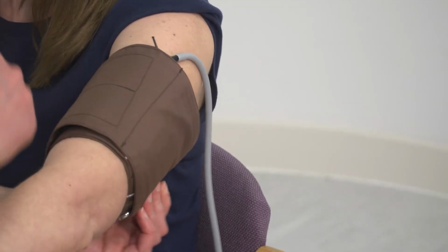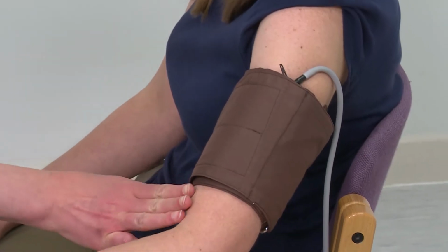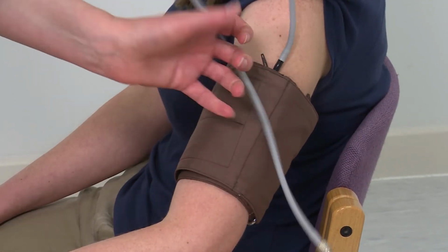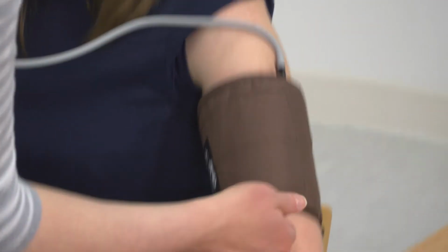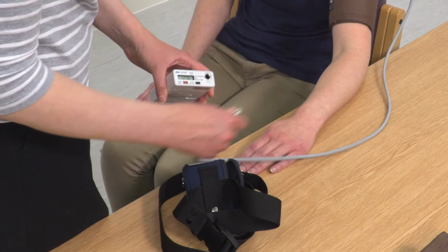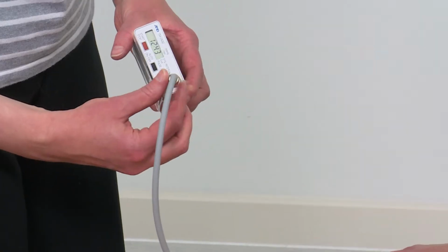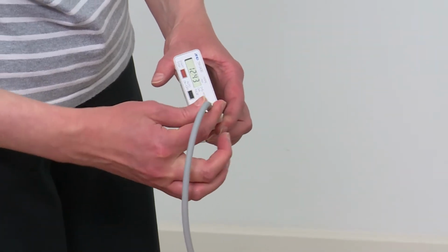The bottom of the cuff should sit at least 3 centimeters above the crease of the elbow. Tighten the cuff so you can fit your first and second finger between the cuff and the patient's arm. If the cuff is not positioned correctly, the recorder may not measure the blood pressure correctly and an error may occur. Connect the cuff to the recorder by screwing it in. Ensure the tubing is not obstructed.